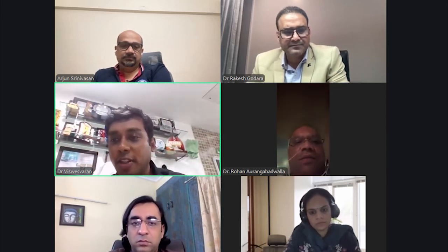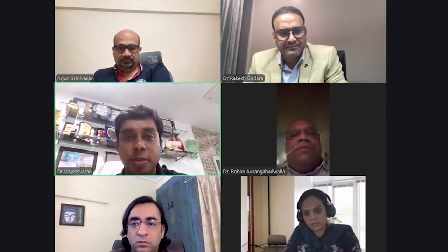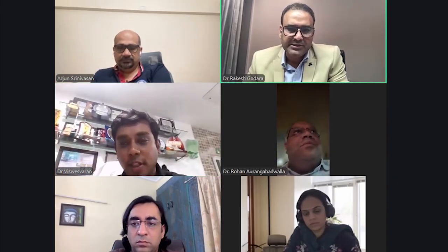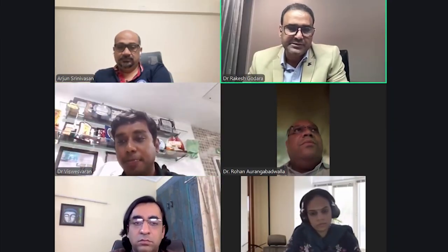And Dr. Sandeep from Bhopal: why is high FiO2 the single most important risk factor during hot therapy in bronchoscopic therapies? To Dr. Rakesh. Because it can cause an airway fire, because more oxygen is a very good medium for combustion. You can have a blast and then serious injuries.